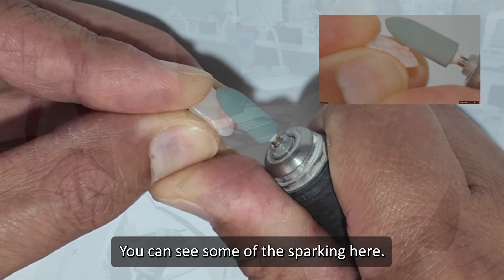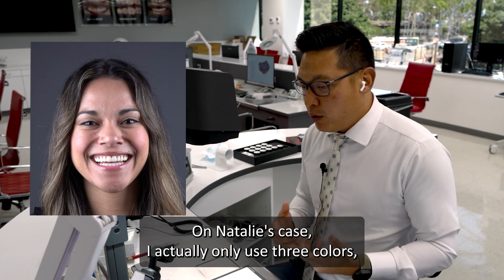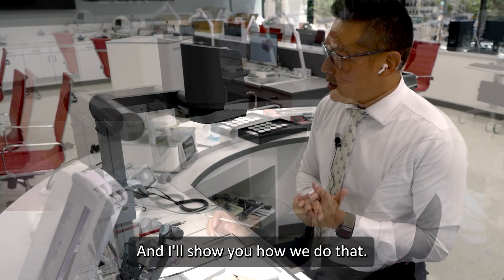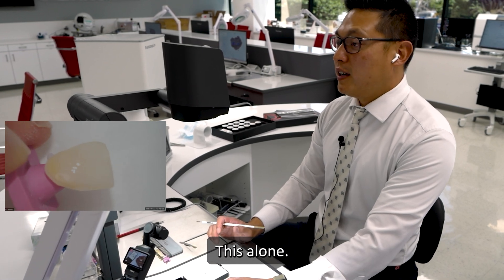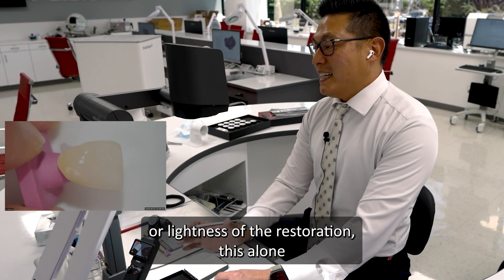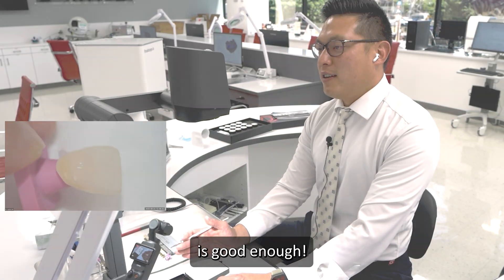You can see some of the sparking here. On Natalie's case, I actually only used three colors. And so we were able to get a really nice effect from three colors. This alone is already a great result. This is a polychromatic effect. If all you really needed to do was tone down the brightness or lightness of the restoration, this alone is good enough.